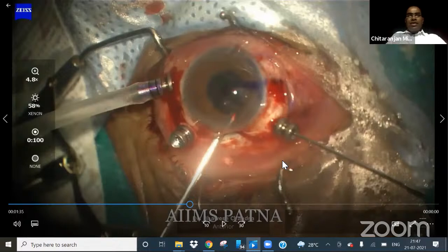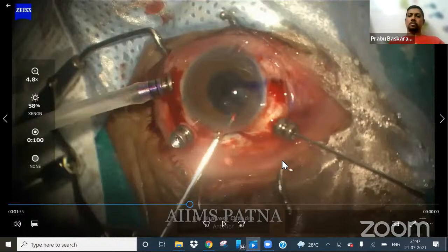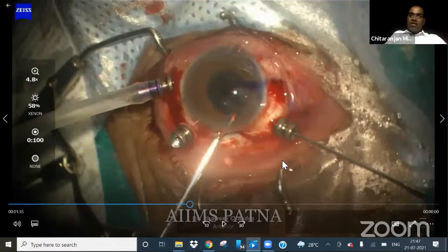And another small tip in the PMM, like rigid IOLs, it's a combination of what Dr. Prabhu and Dr. Abhishek were telling. Just make it stand erect, kind of vertical. Hold it at the optic-haptic junction, or the mid of the haptic. Make it erect, so that when you take it out through the tunnel, the other haptic will be in the pupillary plane. So you can take it easily with the help of an assistant, sister or nurse, which is helpful in these cases.